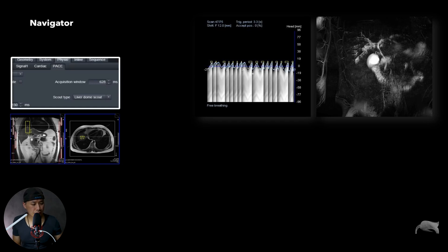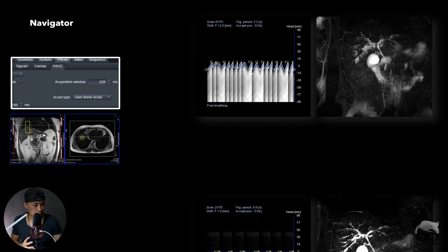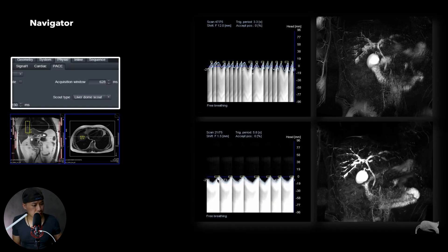Even if the navigator is placed perfectly, if the patient is breathing irregularly without a consistent pattern, you'll get images like this — this is a MIP of a thin slab, and it's not good. After talking to the patient and preparing them better, you get a consistent breathing curve, and the image results are totally different. This is the same patient — just an example of how much breathing consistency matters.